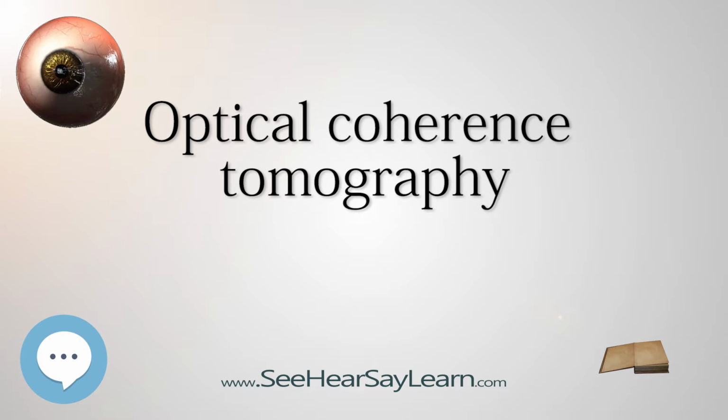Introduction. Starting from white light interferometry for in vivo ocular eye measurements, imaging of biological tissue, especially of the human eye, was investigated by multiple groups worldwide. A first two-dimensional in vivo depiction of a human eye fundus along a horizontal meridian based on white light interferometric depth scans was presented at the ICO 15 SAT conference in 1990. Further developed in 1990 by Naohiro Tanno, then a professor at Yamagata University, and in particular since 1991 by Huang et al., in Professor James Fujimoto's laboratory at the Massachusetts Institute of Technology.